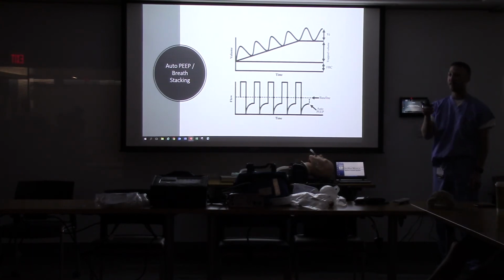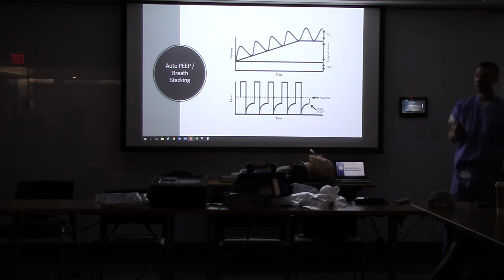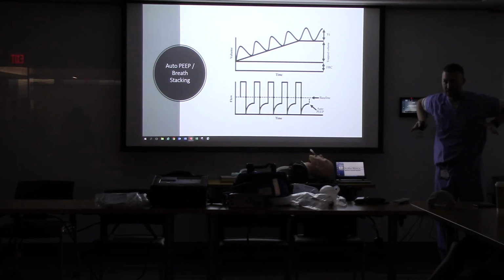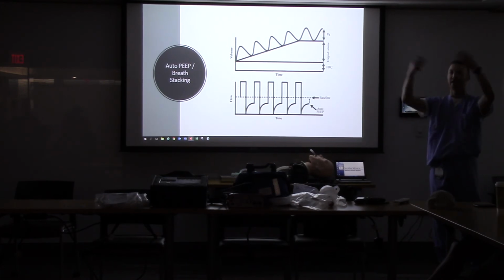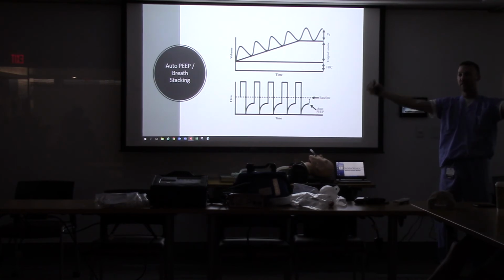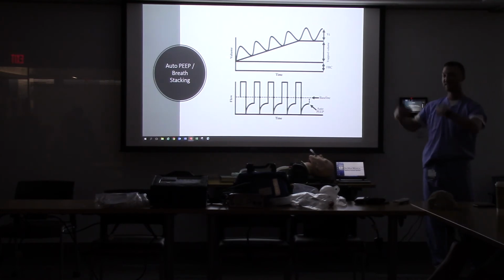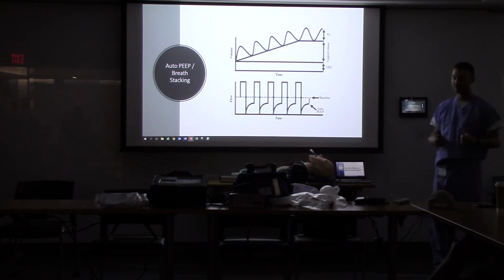And then if you've ever had a patient already on a ventilator who coded on you, one of the first things you should do is disconnect the vent tubing from the patient and let them breathe out. And sometimes we'll actually get on their chest and push down and just forcibly exhale all the gas out of their chest, and then the blood pressure will return. It's like relieving a tension pneumothorax that's inside the lung as opposed to outside the lung.